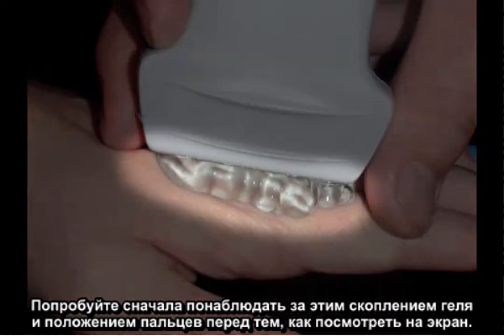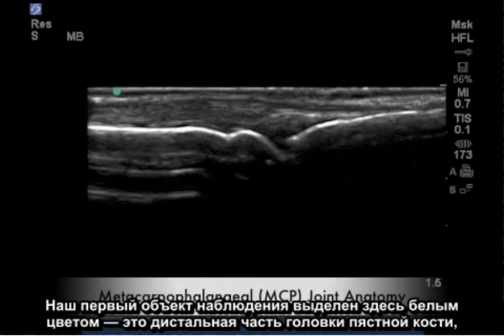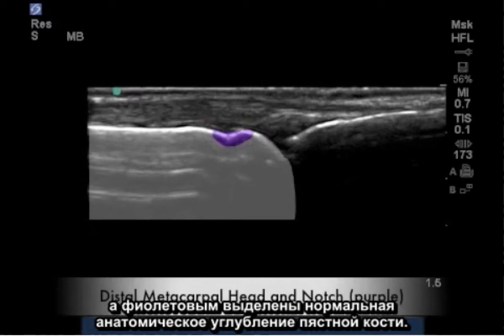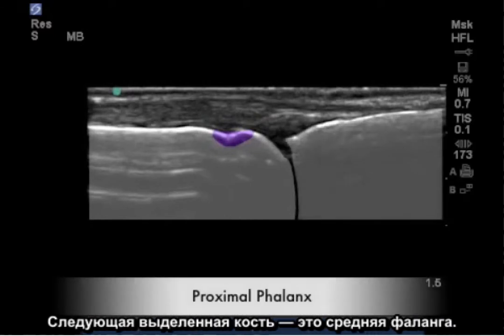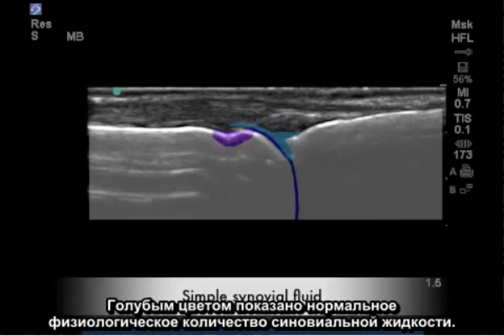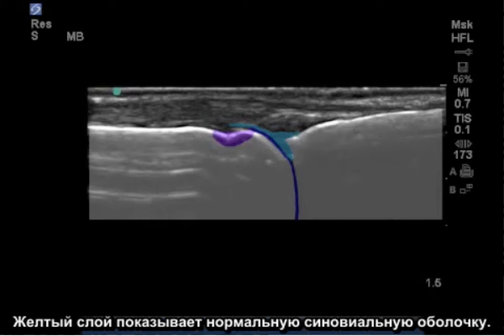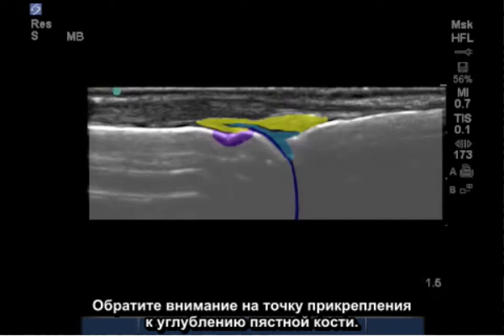Try first to observe the gel heap and the position of the fingers before looking at the screen. Our first observation, highlighted here in white, is the distal metacarpal head, and highlighted in purple is the normal anatomical metacarpal notch. The next highlighted bone is the proximal phalanx. Note the joint space in the normal image also reveals a normal appearing hyaline cartilage, highlighted in dark blue. The light blue indicates the normal physiologic amount of synovial fluid. The yellow layer indicates the normal synovial membrane. Observe its attachment point into the metacarpal notch.